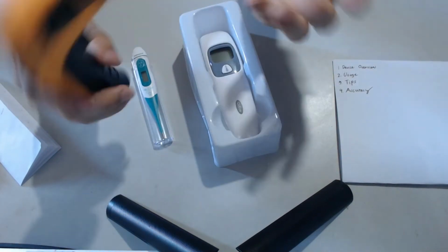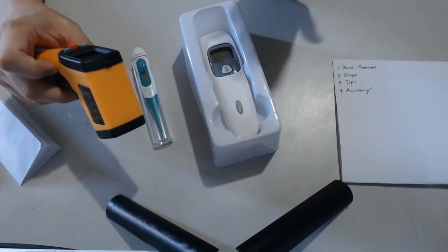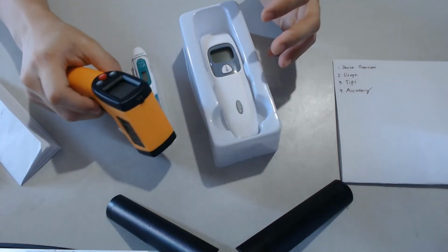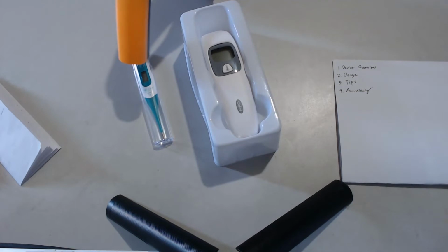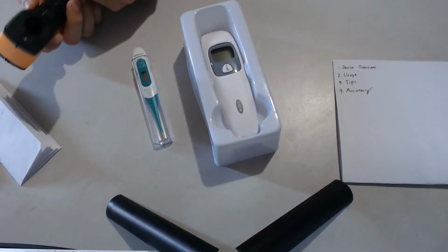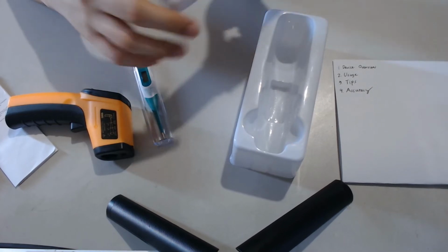Why? Because you're measuring the external body temperature, which is subject to a lot of environmental effects. Like, if it's cold, if you're on the aircon, if you just drank water, if you're breathing cold air, those will all affect the external temperature of your body. The internal temperature, however, is more stable. This is why this thing has the ear, the head, and the object measurement mode.